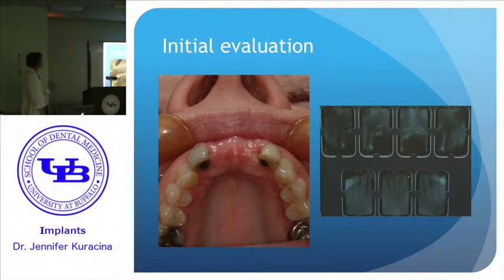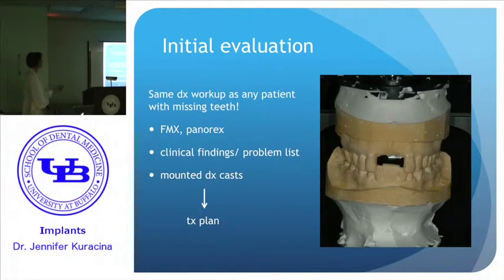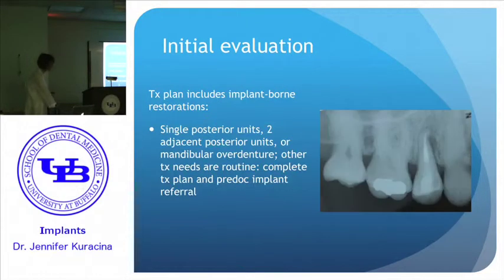So patient treatment, and again, we talked about this at length. We're going to treat every partially edentulous patient the same. We're going to do the same things for all of them: same radiographs, same problem list, mounted diagnostic casts, come up with a treatment plan.